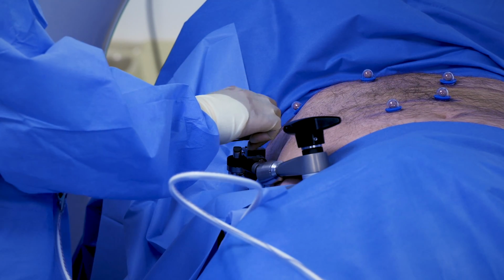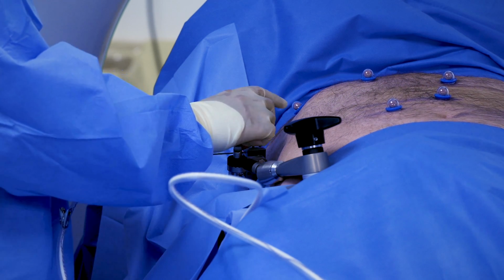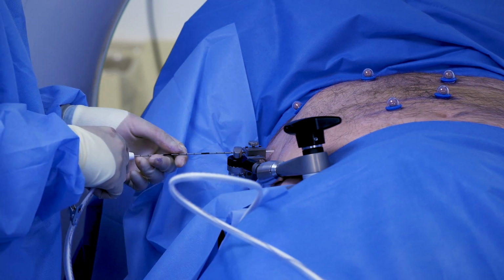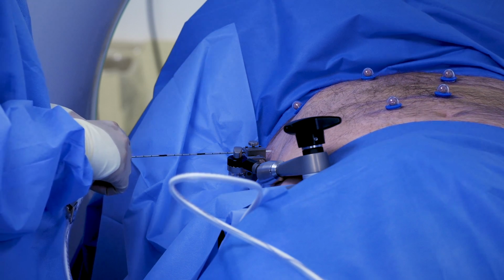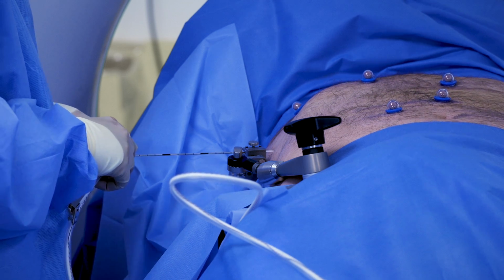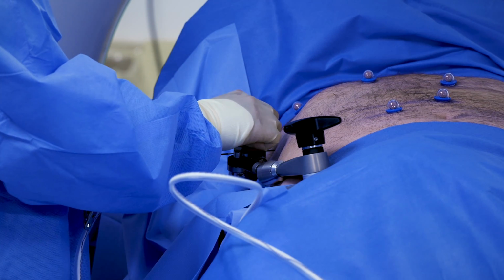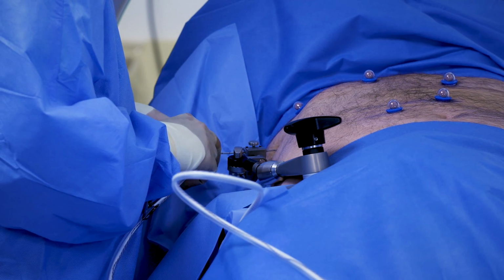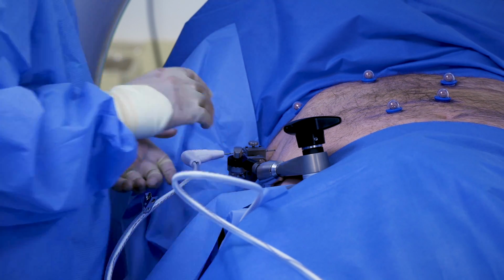Depending on the sharpness of your needle or antenna, you may need to make a skin nick. With this particular device, you usually don't. Can we just hold breathing, please? And breathing on, please. Thank you.